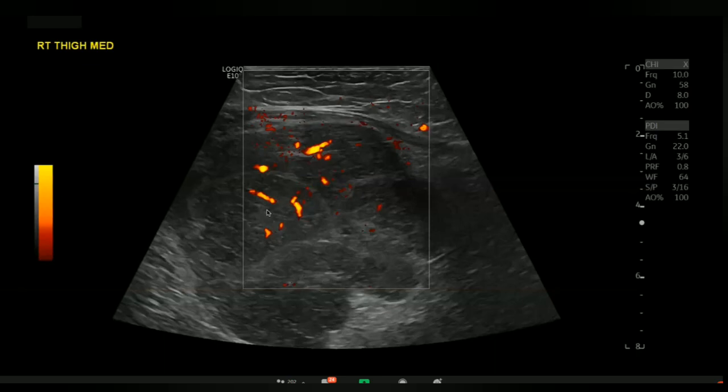Can you tell me what this is on the ultrasound scan? Sir, likely it is a soft tissue sarcoma, liposarcoma, a soft tissue lesion. It could be a sarcoma. We don't really know, but it could be a sarcoma. That's a reasonable guess. But the bottom line is you can't really tell exactly what it is in terms of its nature. What you can say is it doesn't look like fat. It's irregular. It's got vascularity. What's the next thing you're going to do? Sir, MRI scan. Okay, good.